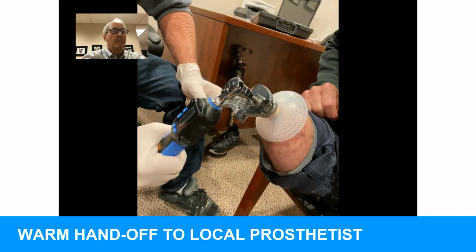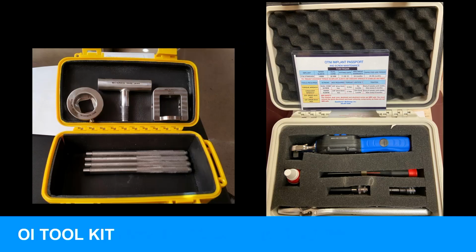When the patient leaves the University of Colorado, I call the prosthetist and say, would you like to do a FaceTime visit? And I will answer any questions. I will talk about the specifics of the individual patient, and then we'll go over how to tighten the screws. And here, this is very common. This is a great prosthetist from San Francisco, and he's actually asked me to do this 3 times on the same patient because he's not comfortable doing it on his own yet. I'm happy to do that for you.